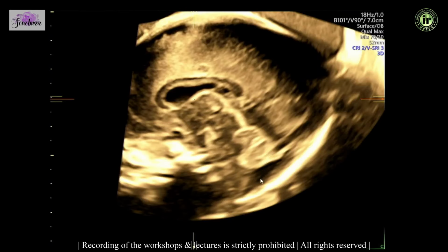So we need to do some measurements. We take the superior inferior diameter of the cerebellar vermis, anterior-posterior diameter of the vermis here. We can take the anterior-posterior diameter of the midbrain, the pons, and these are some of the measurements that we look at.